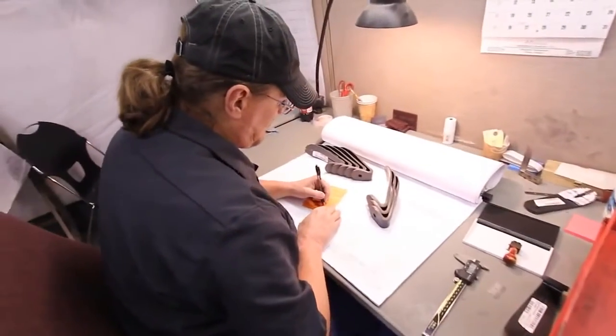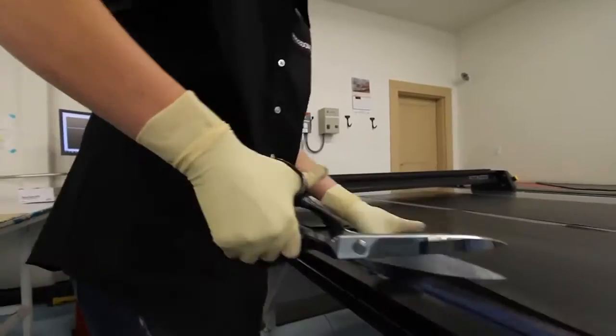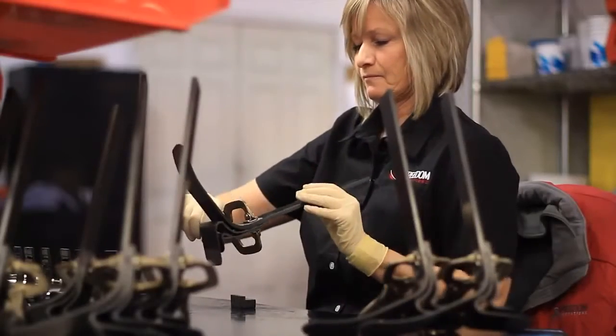Precise quality standards are followed throughout the manufacturing process. Whether it's material selection, lay-up techniques, temperature controls, or final assembly, every detail makes a difference.